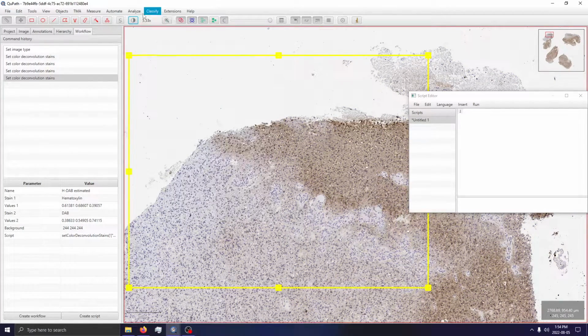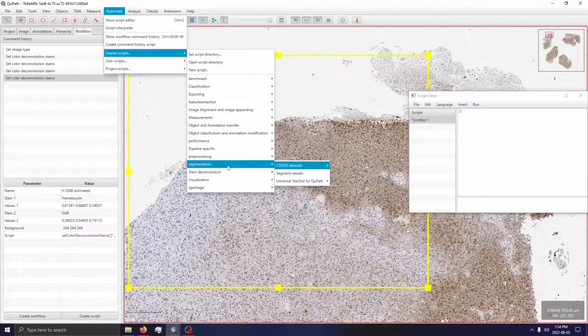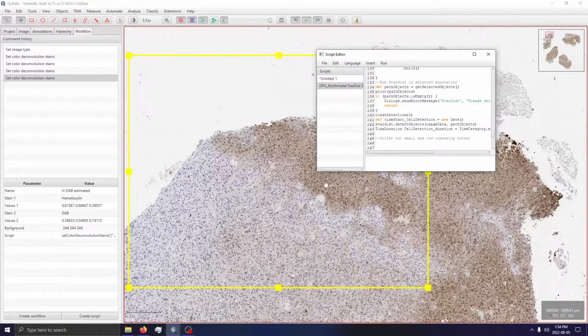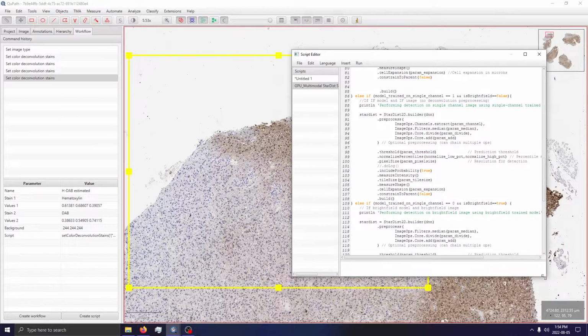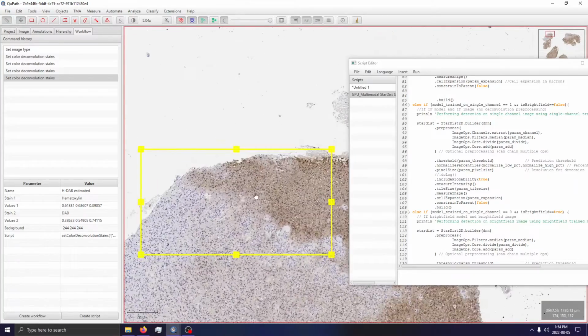So on that note, let me just quickly load up my script. I'll use the GPU accelerated version, but it really won't make that big of a difference. And I'll just shrink down the area just a little bit because I don't really have interest in waiting for this whole thing to finish processing.